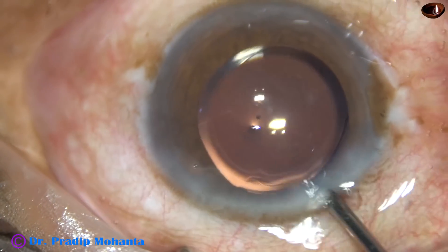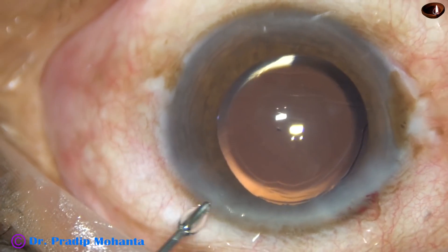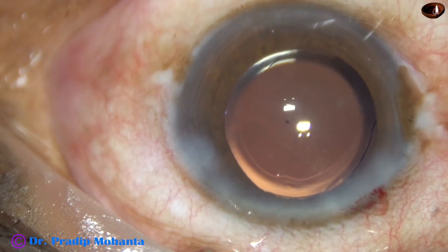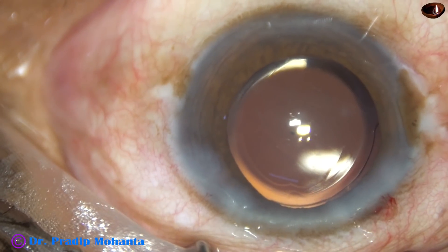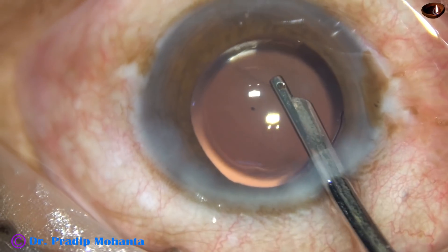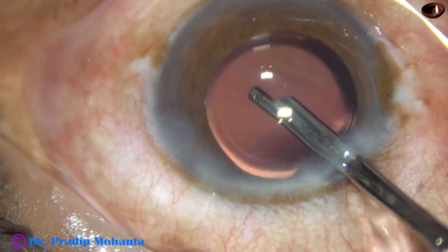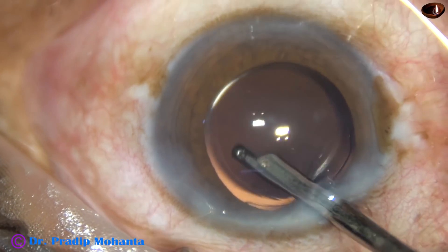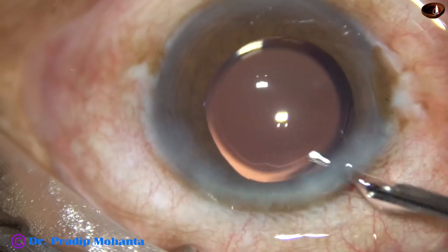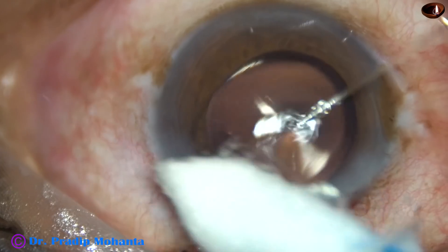And this is a bit of irrigation. We have only one side port in this case — a little bit of moxifloxacin is applied. Now the single side port made is hydrated and it is closed. Then a final lavage of the anterior chamber is done — the fluid jet is directed towards the corneal endothelium very gently, and visco sticking to the corneal endothelium gets dislodged and comes out. It never causes any damage to corneal endothelium. This is formation of the anterior chamber, and then with the help of a cotton-tipped instrument, the wounds are checked.